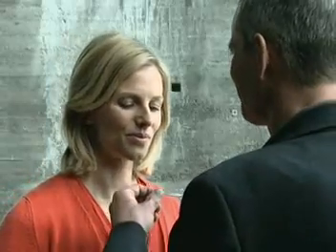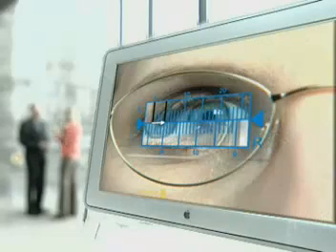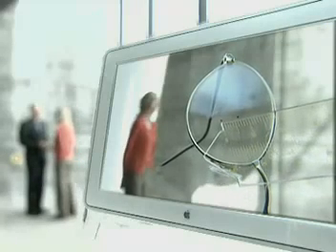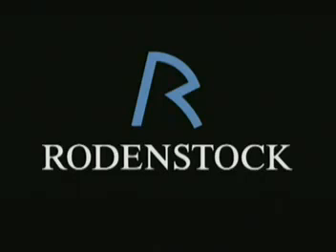As you see, it takes just a few moments to determine the required values to calculate Impression ILT. The PD always has to be measured anyway. The only additional values are those for the corneal vertex distance, the pantoscopic tilt, and the dihedral angle. You and your patients profit from Impression ILT. High spontaneous compatibility, reduced swimming, and optimized vision zones provide substantially more vision comfort. And your patients receive sound and individual advice. The Individual Progressive Lens, Impression ILT.